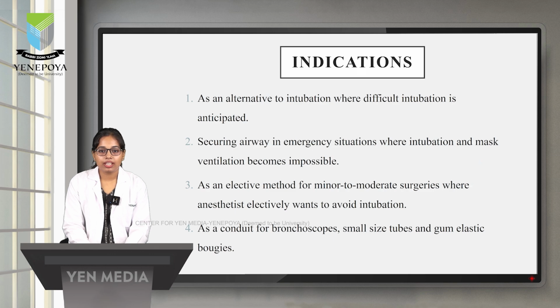The indications of laryngeal mask airway are: it works as an alternative to intubation where difficult intubation is anticipated; securing the airway in emergency situations where intubation and mask ventilation become impossible; as an elective method for minor to moderate surgeries where an anesthetist electively wants to avoid intubation; and as a conduit for bronchoscopies and gum elastic bougies.